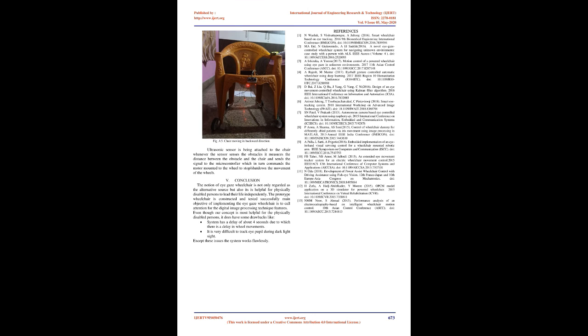When the resultant of the image processing technique is of minimum value, the motor mounted to the wheels of chair gradually turns to the left side and chair starts to move in the left direction of motion. Fig. 4.2. Chair moving in left direction. When the resultant of the image processing technique is of maximum value, the motor mounted to the wheels gradually turns to the right side and the chair starts to move in the right direction of motion. Fig. 4.3. Chair moving in right direction.